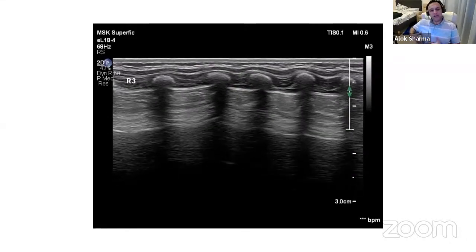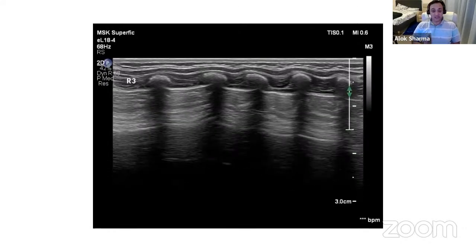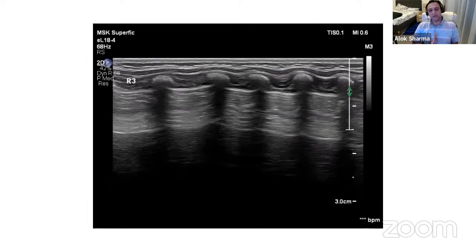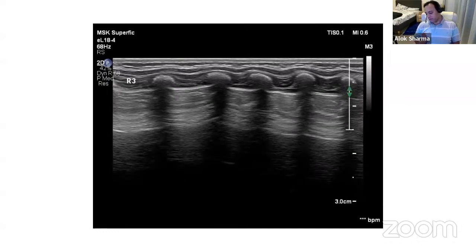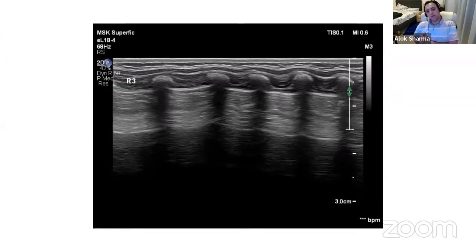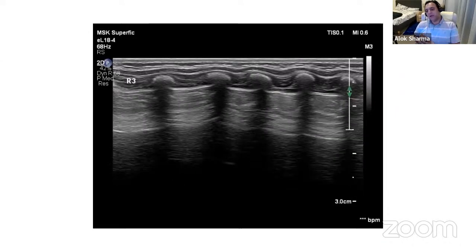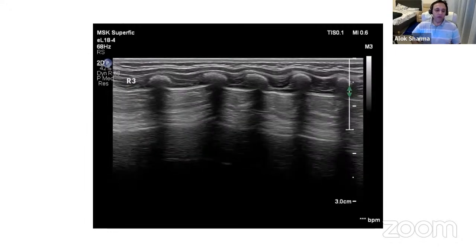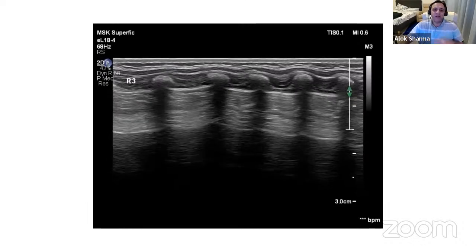Now, because air is going to rise anteriorly, if I can see and I make a diagnosis that I worry is a pneumothorax on that right side because it's clinically the case, then I will gradually move my cursor around, trying to locate the lung point to see how large this pneumothorax is. And that will help quantify it. If I'm going to R3 and I've got this kind of sign, that's a pretty large pneumothorax.